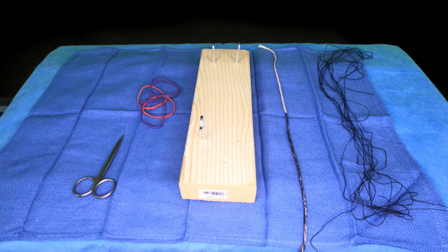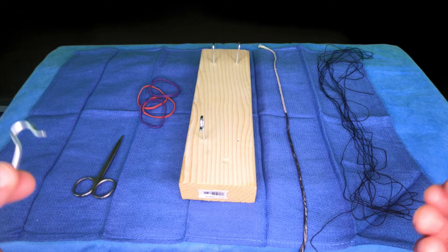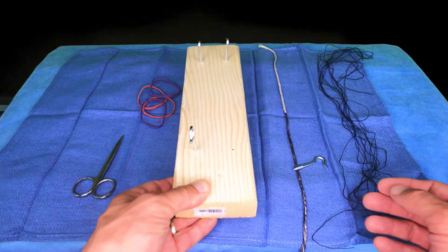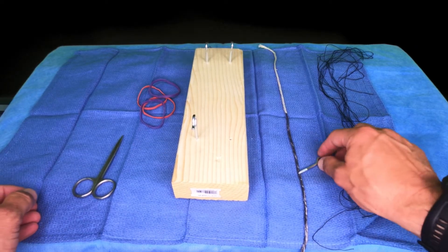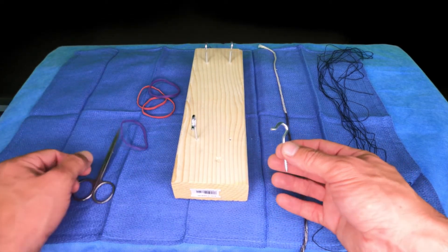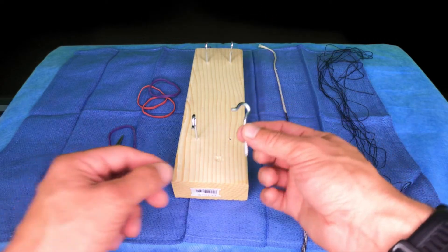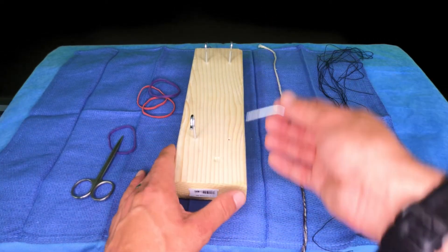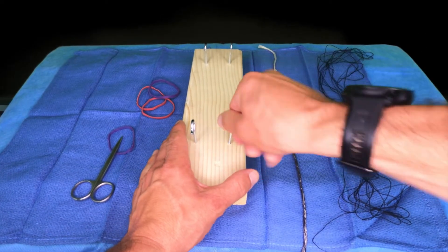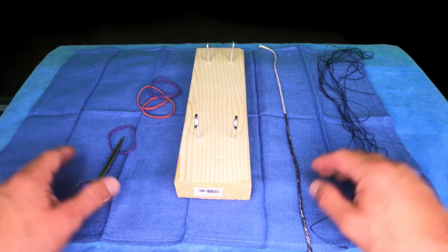Here's my knot-tying setup — definitely a DIY setup. Here are some things you're going to need, and this is the easiest and cheapest way to do it. First, you want a piece of wood, about a foot long — pick it up at Home Depot or Lowe's for a buck. The second thing is a little bag of hooks, which allows us to put some rubber bands in there, because you want to learn to tie under tension. I put the hooks about 20 centimeters apart, and once you have your hooks, you can put a rubber band on.